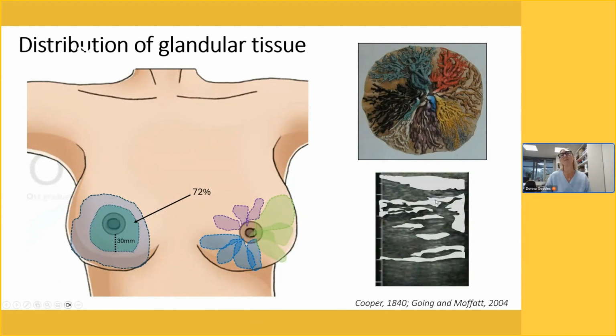And you can see that amongst the glandular tissue, there is quite a bit of adipose tissue. So whilst the textbooks might say that most of the breast becomes glandular tissue and that adipose tissue is necessary for it to develop, we in fact find some women with big breasts, up to half of their breasts, can be composed of adipose tissue.